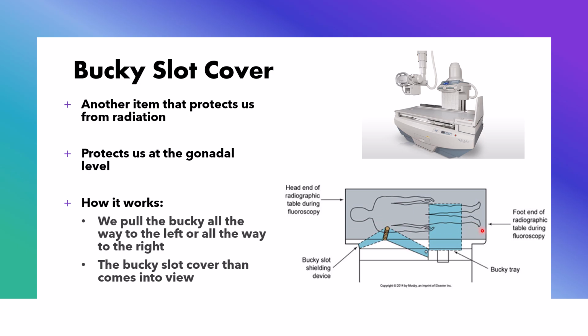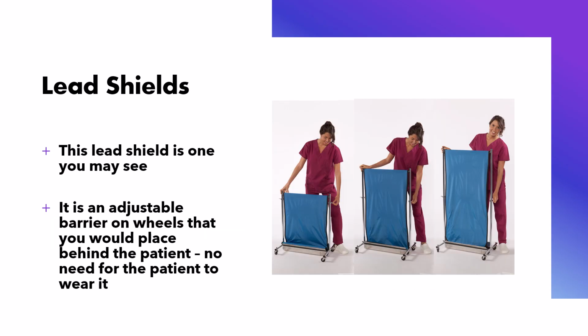When you move the Bucky down out of the way, this goes out here and it's lead lined, and as you move the Bucky here, it comes into place and blocks the x-rays coming from the underside of the table. And again, those weren't always used either.